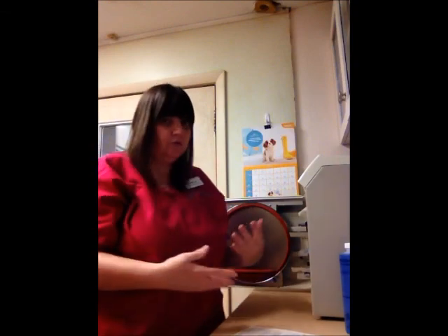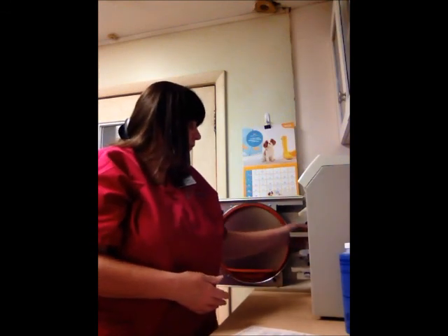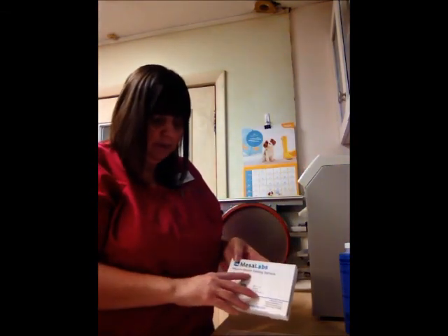We run 2 of those, emptying the water each time to make sure that all of the cleaner is out and not involved in the steam that will be sterilizing our instruments. We'll then refill it up with distilled water, and it'll be ready for our next surgery cycle of instruments to be cleaned. Once a month, we also use Mesa Labs, so we send in the mail-in spore testing. We'll run a cycle with our spore test in it, and then we mail it out, and then they email our boss with the results, and so far so good. We have not had any negative results so far.